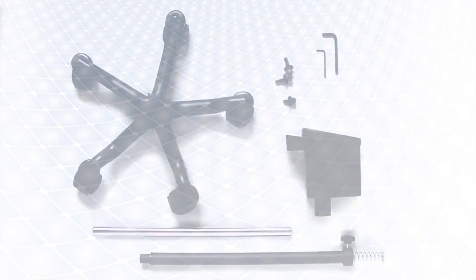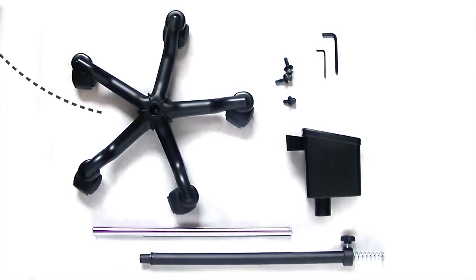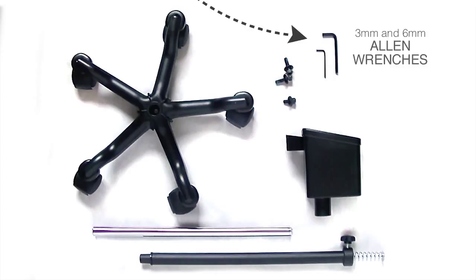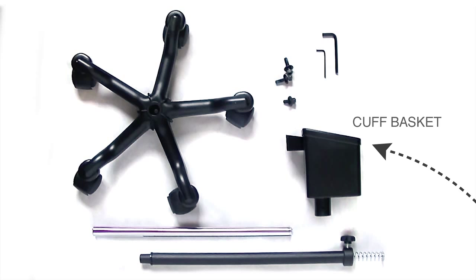Your 752M-02 stand includes a pre-assembled castor base, a stainless steel inner pole, a coated outer pole, 3mm and 6mm Allen wrenches, and a cuff basket.